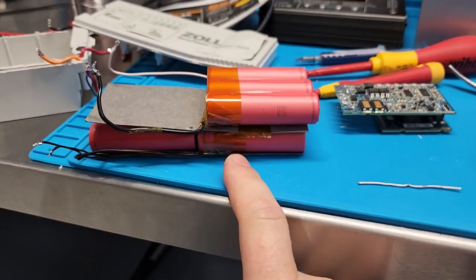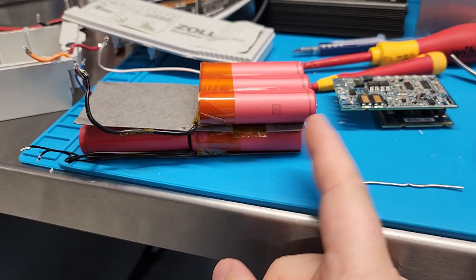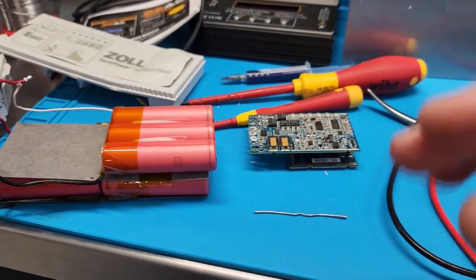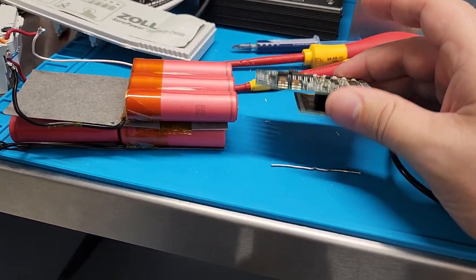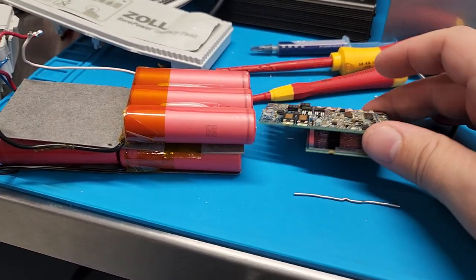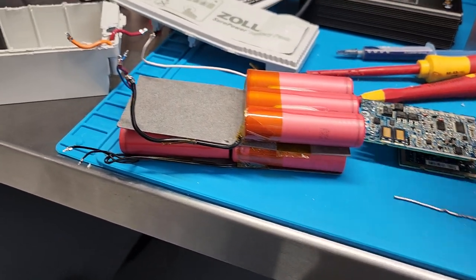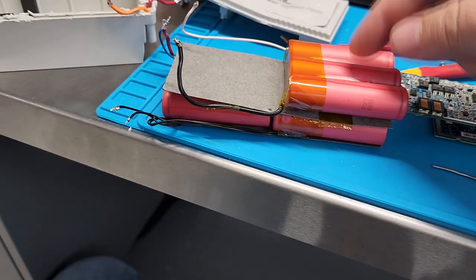If you have this sitting in your biomed shop waiting to go into a piece of equipment, it will naturally drain down to nothing, so you have to buy more batteries. They'll say it's a safety feature — that's how they'll advertise it — but really it just wears it down. I've got 12 batteries with this exact same problem. Since they're no longer good I took the opportunity to open them up. This is what's inside a ZOLL R-Series battery — and you wonder why it costs $500.